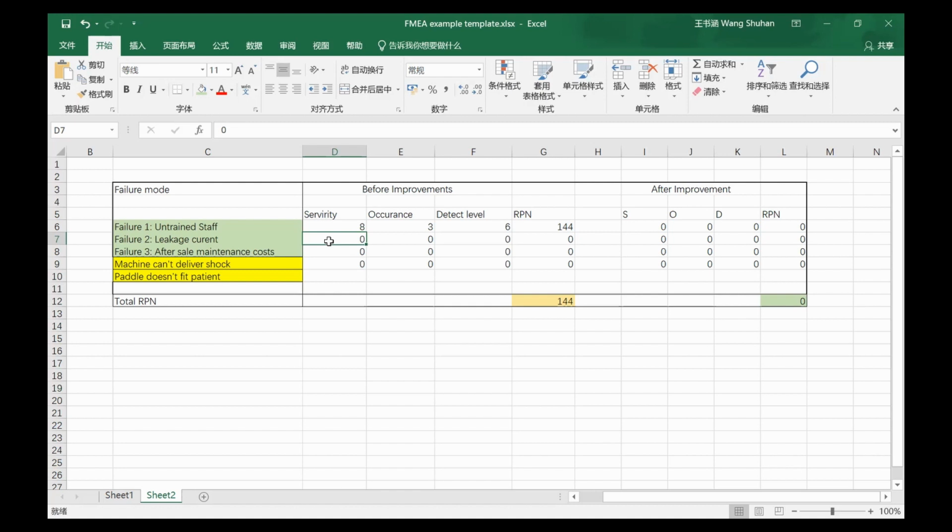Yeah, severity level 9. Yes, I would say probably 8 to 9, because it can lead to a catastrophic failure, because we only have less than 5 minutes to bring our patients back to life. But if it's not charged, we charge it for 10, 20 minutes, the patient is already dead. So yeah, this is a very accurate severity level.